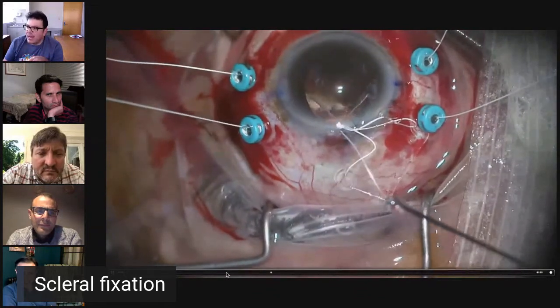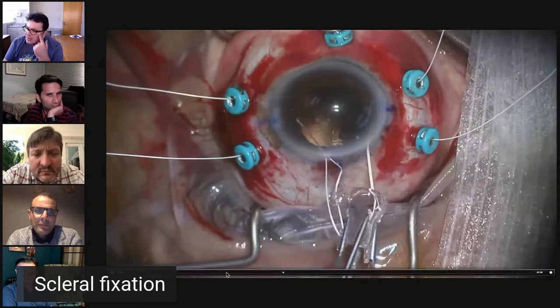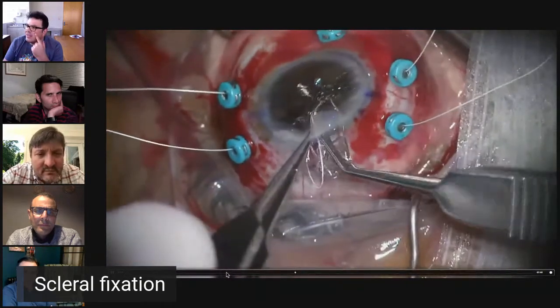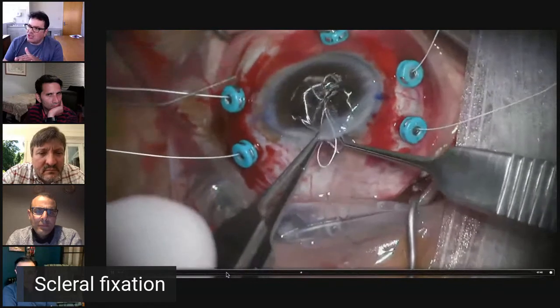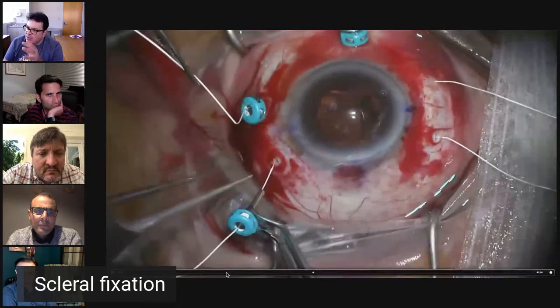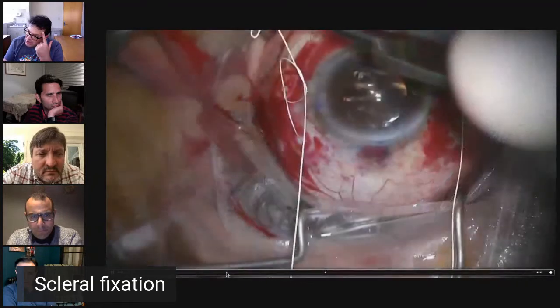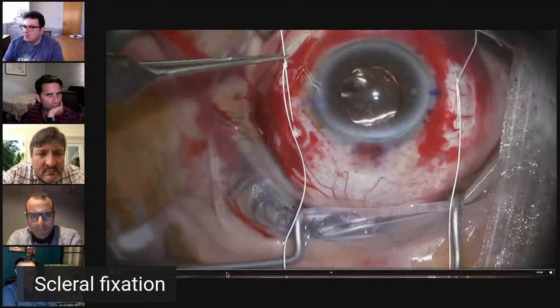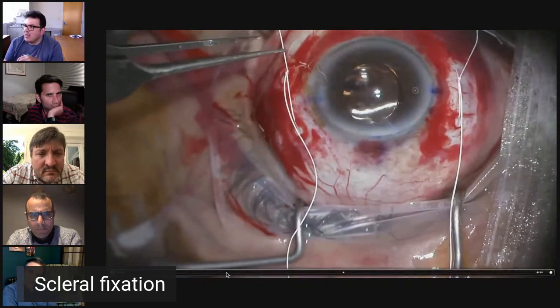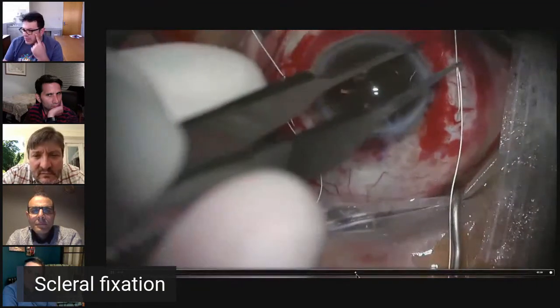And if you have a big wound like I had here, close it initially and then fold the lens. I tried to inject the lens with the sutures, but I failed completely. And here, where you need to manipulate the anterior chamber, really, or the infusion, you have to put it on and off to manipulate things and make sure you don't take your suture out as you do this. Then I use an adjustable suture, and I keep playing with the tension until I'm happy. So I would go to the other side and adjust until I'm happy. And then after that, I would lock it.